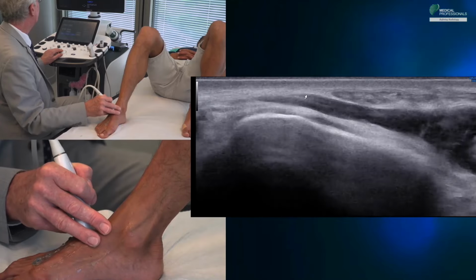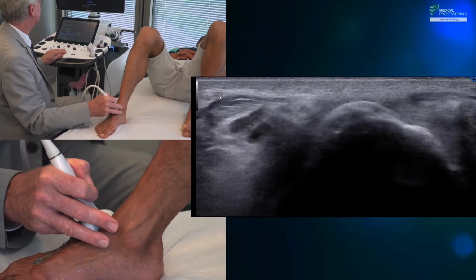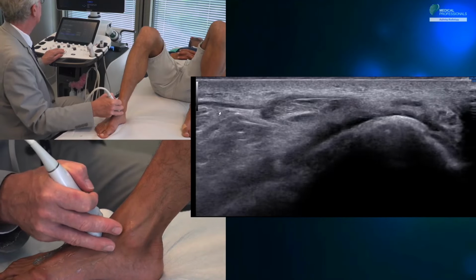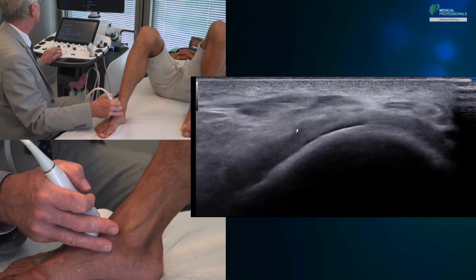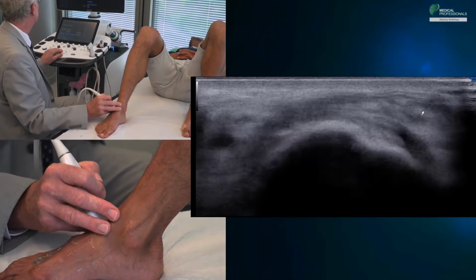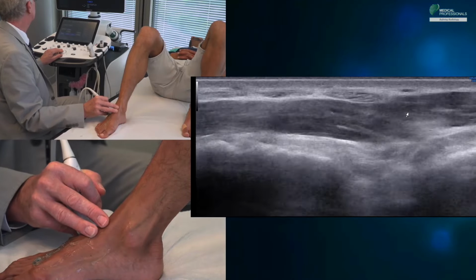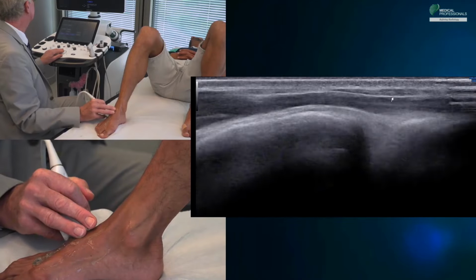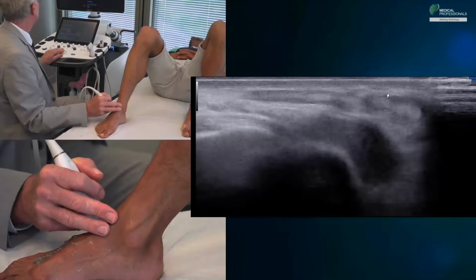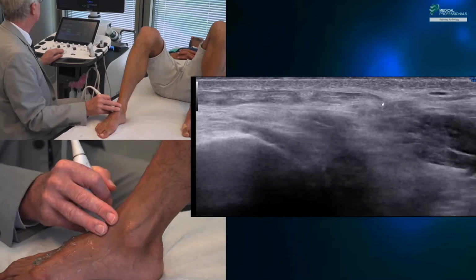This inferior retinaculum also extends to the dorsal face to come here to tie the other extensor tendons opposite the tarsus and plate these extensor tendons against the tarsus. This patient does not have a fibularis tertius, so he does not have the fourth tendon that we can see in some cases. A fibularis tertius would be even more lateral and come to insert on the fifth metatarsal.